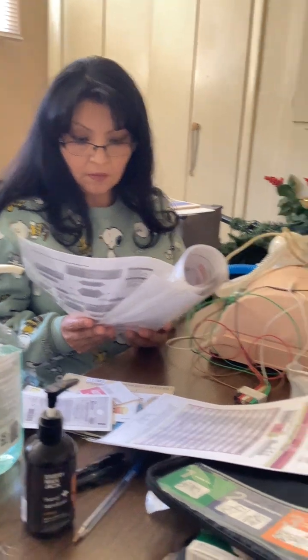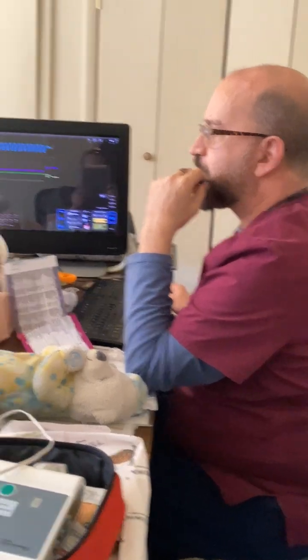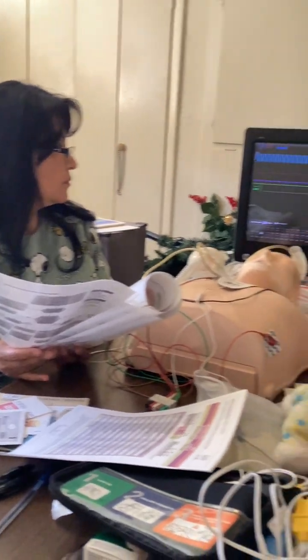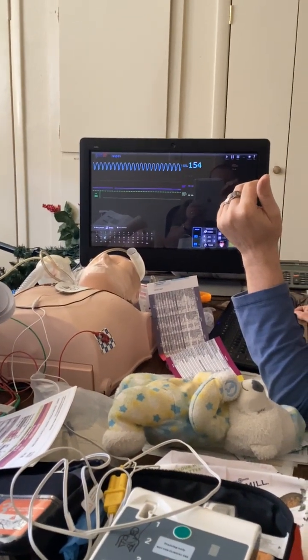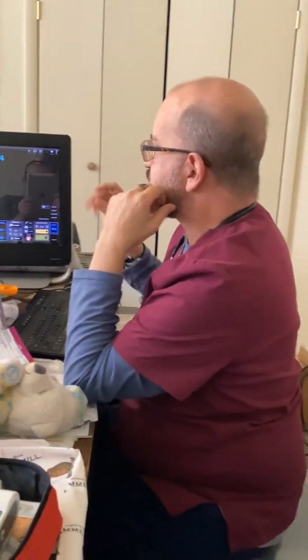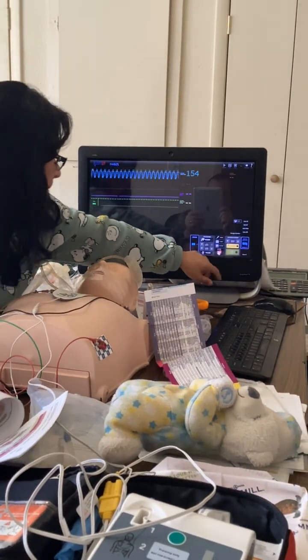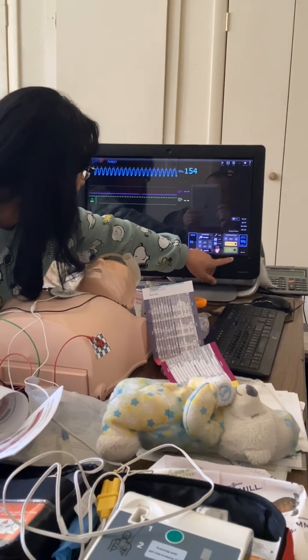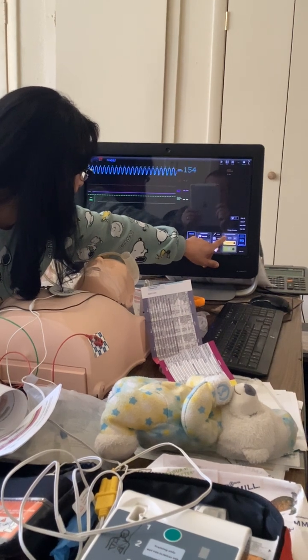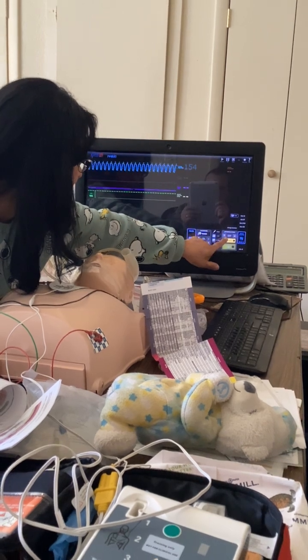So how much would you cardiovert them with? I would begin at 0.5 to 1 joules per kilogram. So half a joule per kilogram is the recommended. So if they're 10 kilos, what's half of 10? 5. Okay, so go ahead and sync. Play with the energy. It's currently at 150. This is it, right? There you go. We'll go up to 50. Oh, what was it going to be at? 5. There you go.